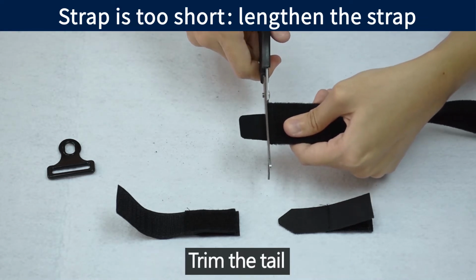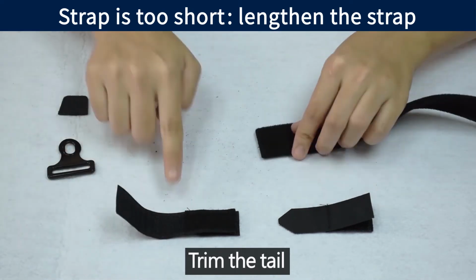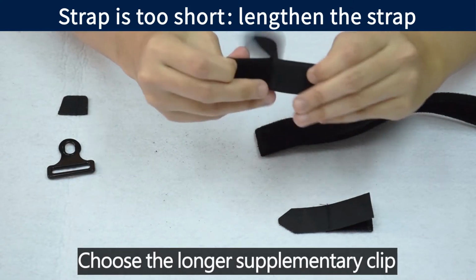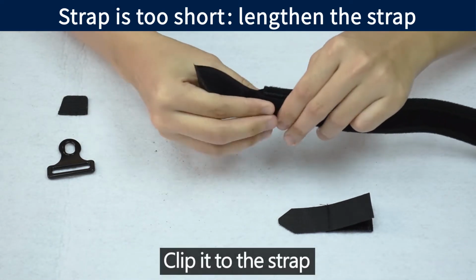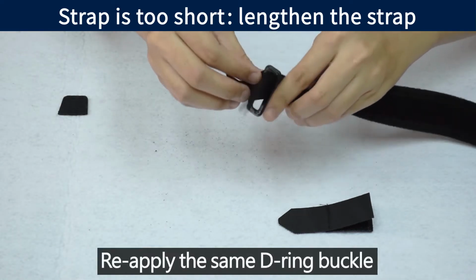Trim the tail of the strap. Choose the longer supplementary clip. Clip it to the strap. Finally, reapply the same D-ring buckle.